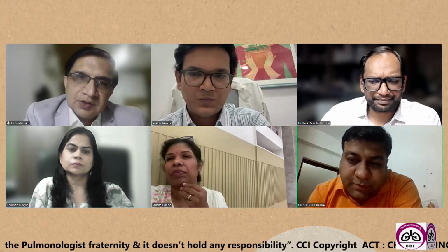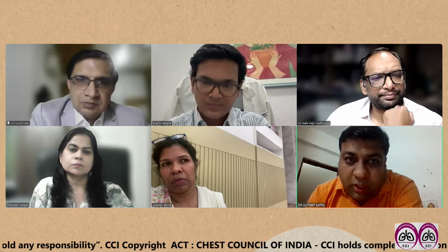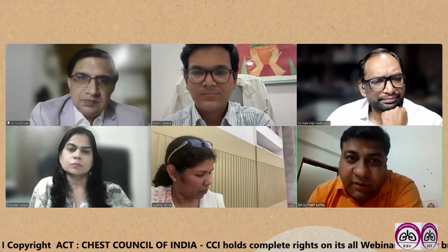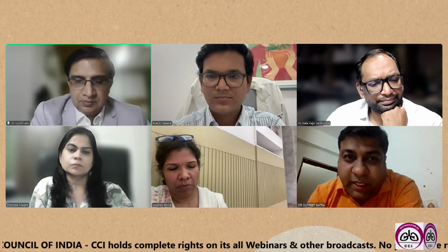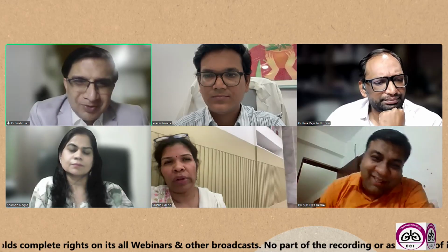So with cryobiopsy, nowadays people are using it upfront to get good tissue. But the main indications are: if you're suspecting a malignancy, to get higher tissue for cell block and next generation sequencing, NGS. Other is lymphoma, that is the second one. And third, if you have a negative ROSE or a negative EBUS the first time. Then definitely the second time you don't want to take a chance. But nowadays people are using it upfront.